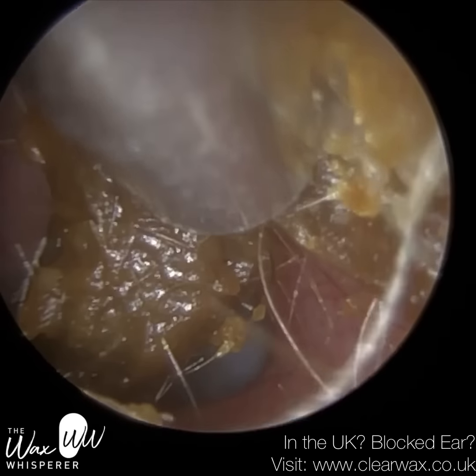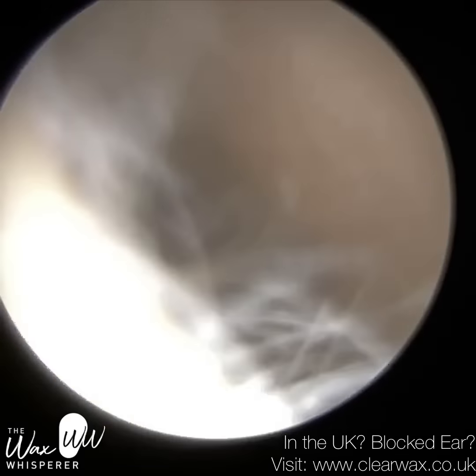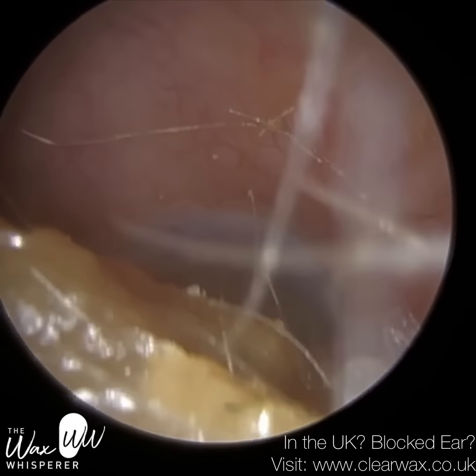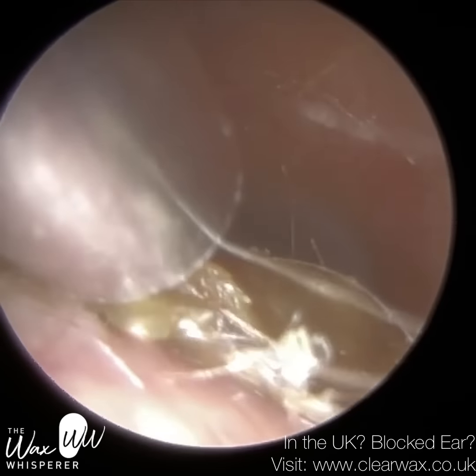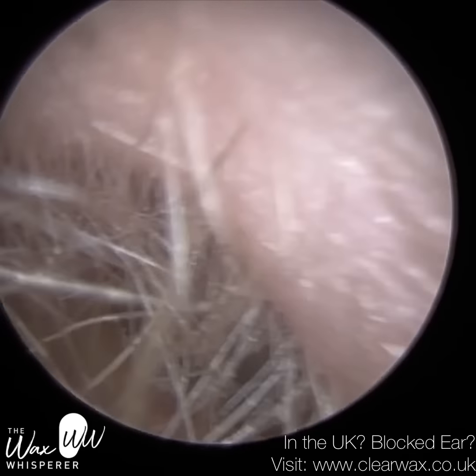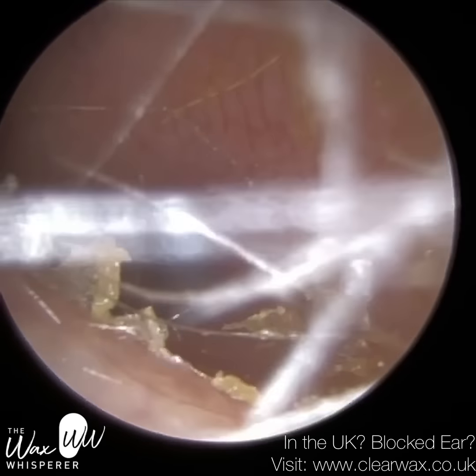They vary in length, so typically they're about, well, actually they don't, they're about 8.5 centimetres. The length itself is about 3.5 centimetres from the distal lens to the tip. There's a 30-degree angulation which helps the insertion of the suction probe into the ear. Without that bend, it would be quite tricky. You'll just have a straight cylindrical tube going into the ear. That bend just provides you with more fine motor control.